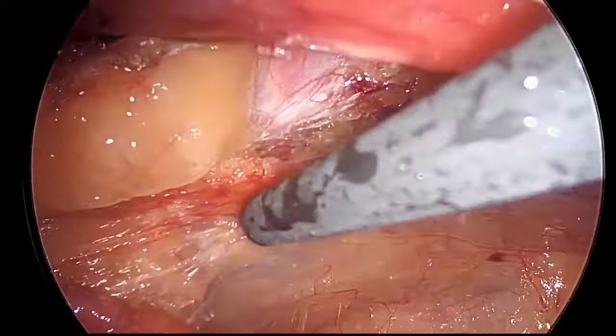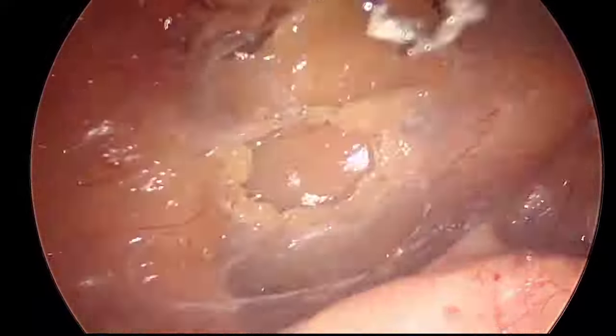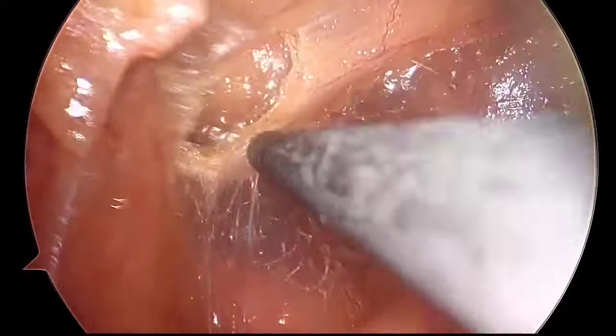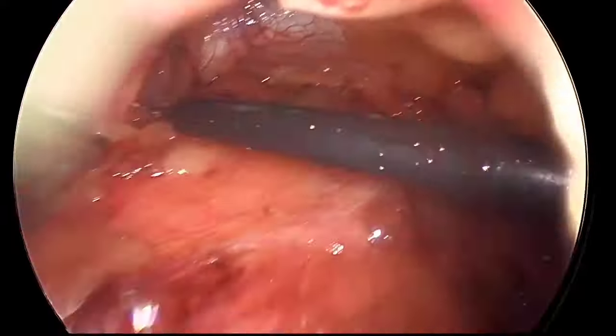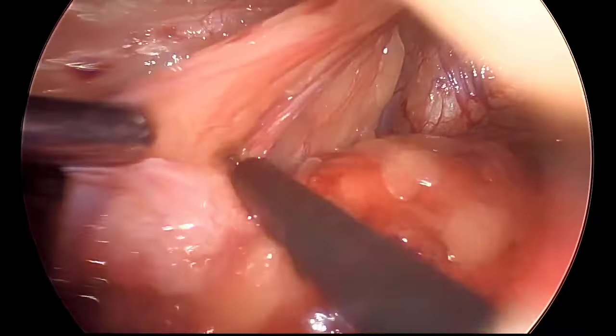So I am doing a further lateral dissection to expose the lateral space of Bogros more enough to put a large mesh in this area also to cover all the potential hernia defect nicely with adequate mesh overlap.